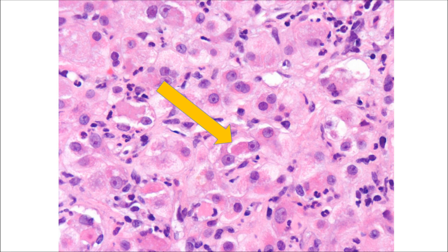One can have long-standing, i.e. chronic steatohepatitic patterns of injury with neutrophils, and hence do not make the mistake of saying it's a neutrophilic infiltrate, hence cannot be a chronic process.